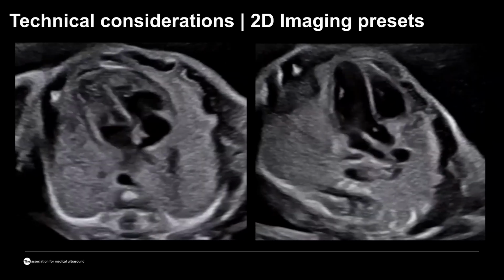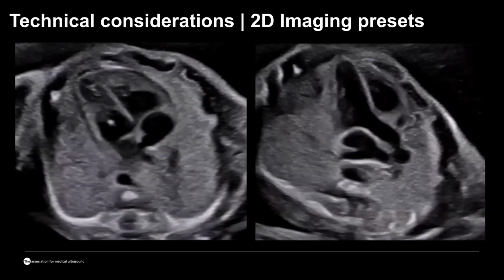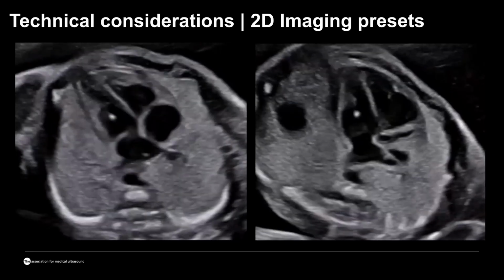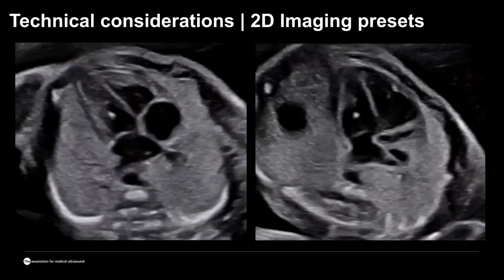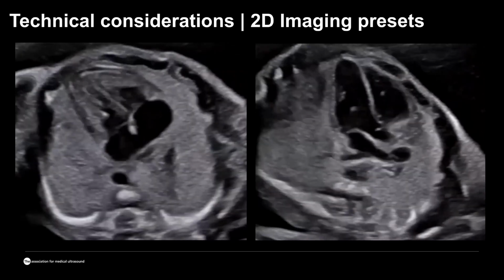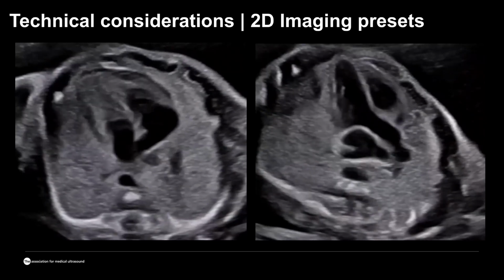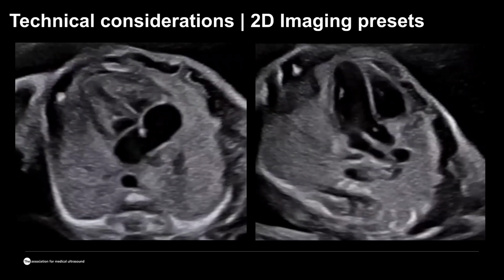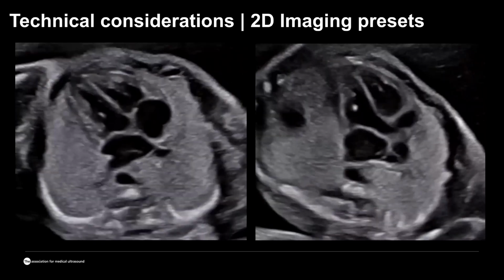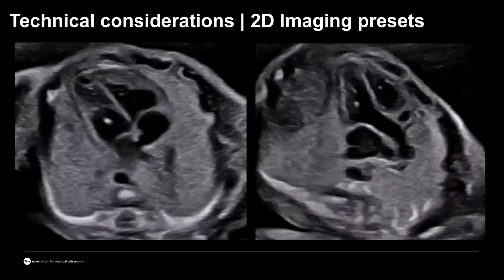The next thing that I would like to talk about is also related to the technical considerations when we are doing fetal echocardiogram. These are different presets and a different approach to the preset. Most of those technologies that we just highlighted can be embedded in the preset. And indeed, once you switch to the fetal heart, all of them can be automatically activated so that you don't really need extra strokes, or extra thought about how you can improve this image. That can be created and customized the way you want it.